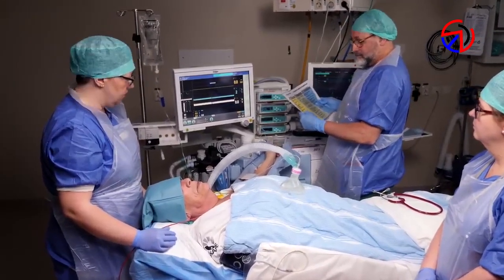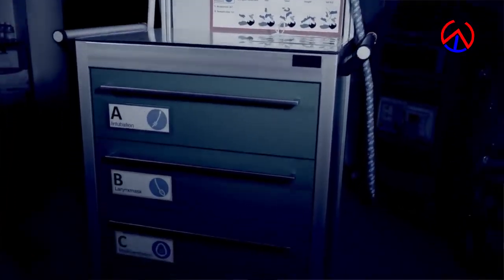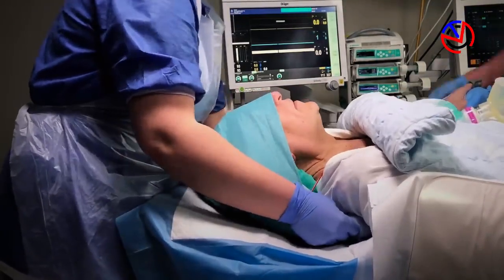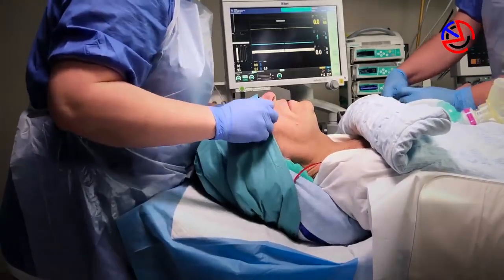Your intubation should always be preceded by an airway assessment. What equipment and personnel does the patient in front of you require, what complications do you suspect may arise, and is everyone on board with the plan if they do?